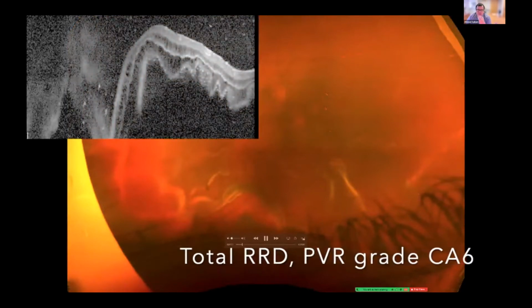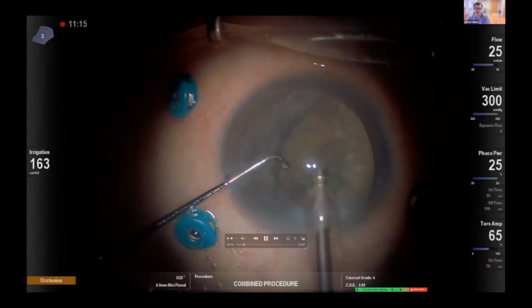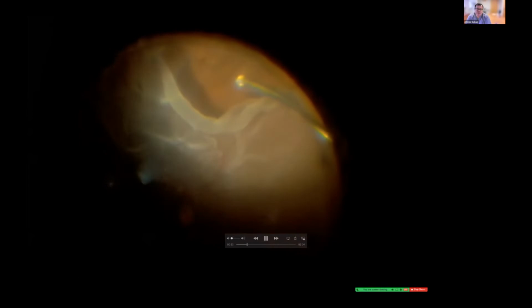So there's a patient with a total PVR detachment and came very late to us, which is very unusual. He came like 2 months after retinal detachment. He was very laid back. Oh, I lost my vision and I decided to come now, 2 months after. Had cataract. Usually we don't remove the cataract unless the cataract is dense to affect the view. And then this is the retina now. He has what looks like more of a giant break there with PVR and pigments.